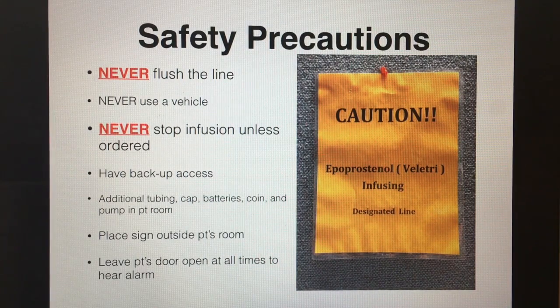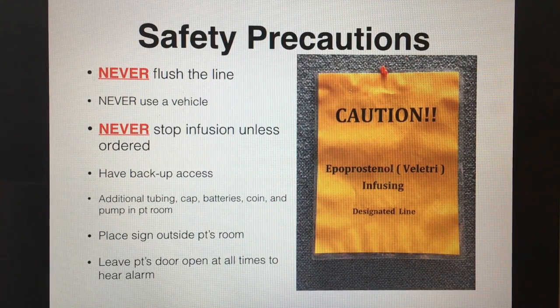You never use a vehicle. If you're having issues with blood backing up into the line, you can consult pharmacy to potentially change the concentration so it infuses at a larger volume to help mitigate some of the backflow, but that's also why we have the backflow caps. You never stop the infusion unless ordered by the physician.